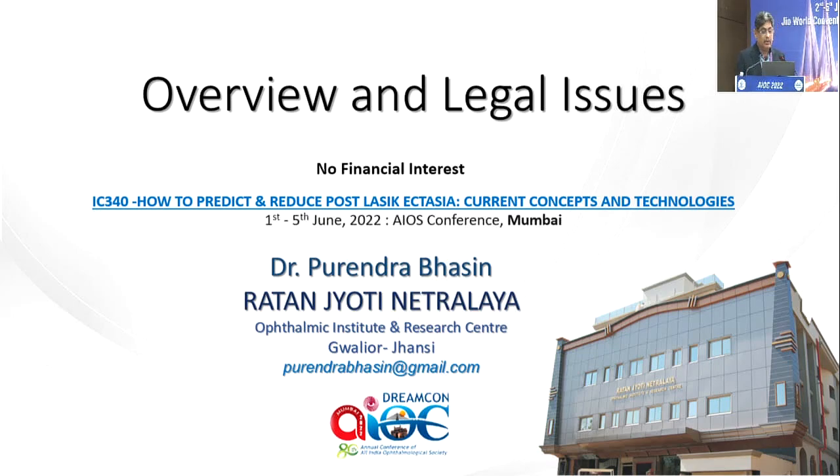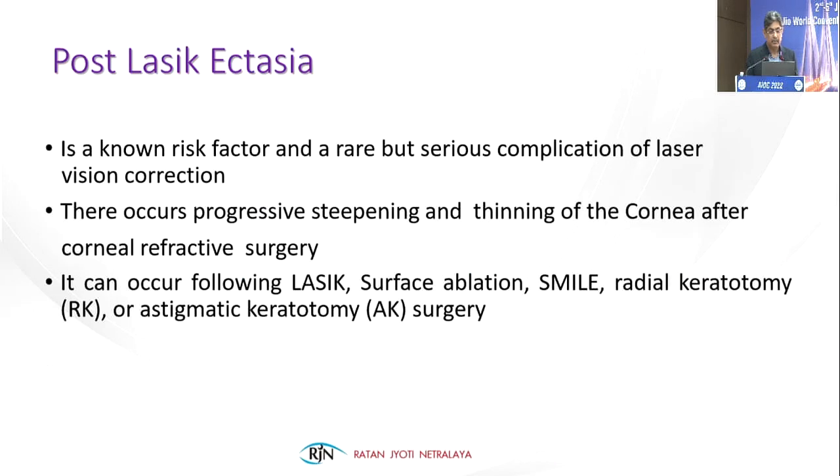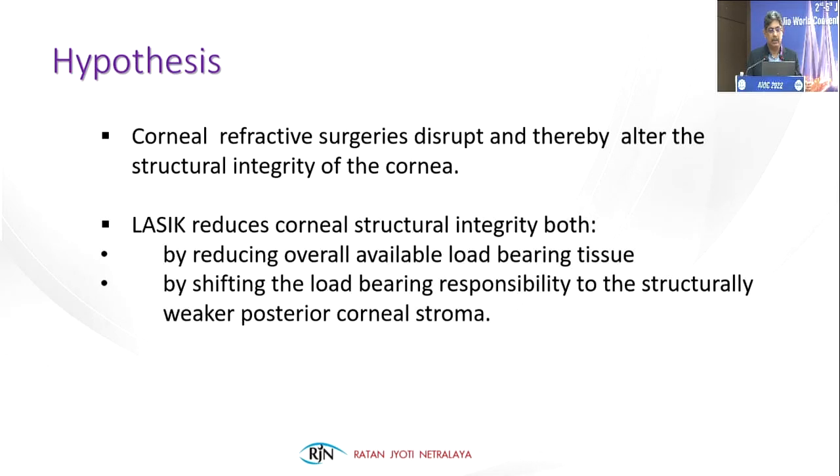So, overview and legal issues. Post-LASIK ectasia is a known risk factor and a rare but serious complication of laser vision correction. There occurs progressive steepening and thinning of the cornea after corneal refractive surgery. It can occur following LASIK, even surface ablation, SMILE procedure, RK, which is obsolete now, or astigmatic keratotomy, which is also obsolete now. So in any form of corneal based surgery, this can occur.